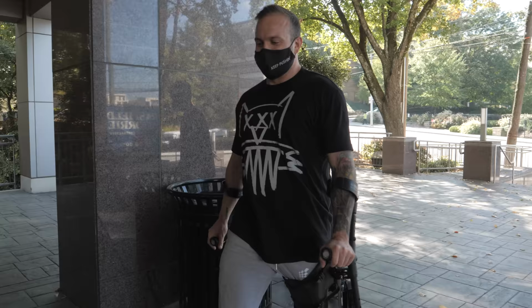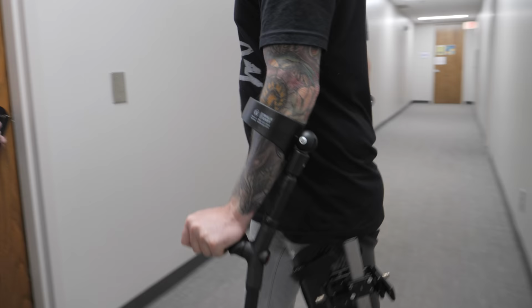Because could be stumbling. Oh, I see what you're saying. So first impressions on the trial is, well, it's a trial. It's precisely made for no one, so it's not going to be fitting exactly the way that my actual brace is going to be fitting me.